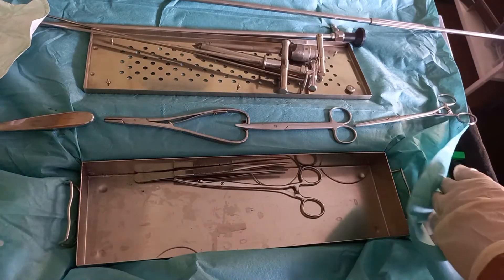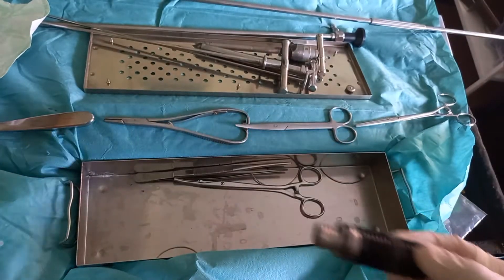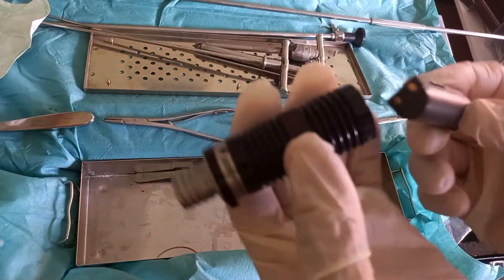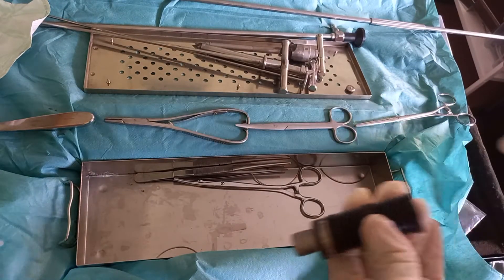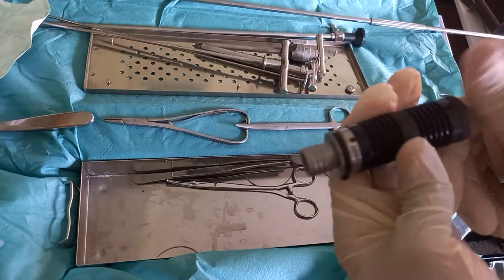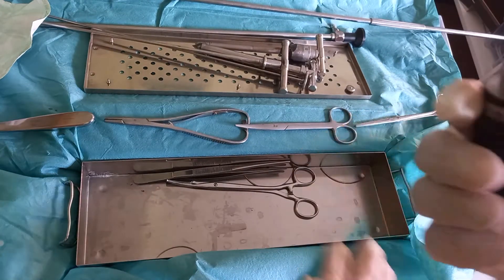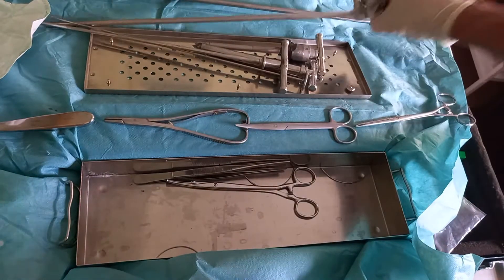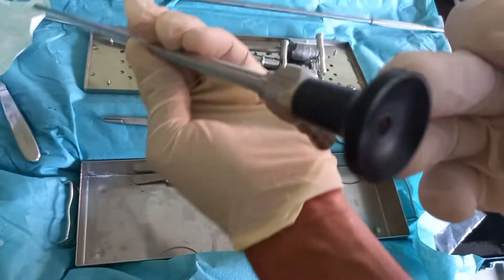An endoscope lamp with batteries will be fixed in the endoscope. We will make sure that the batteries are charged and everything is working before starting the operation.